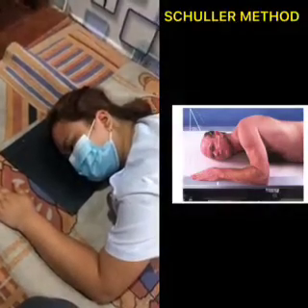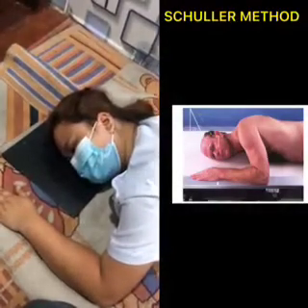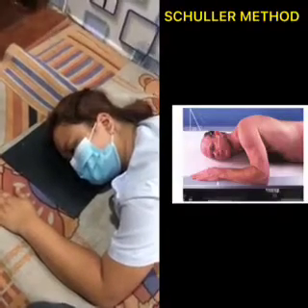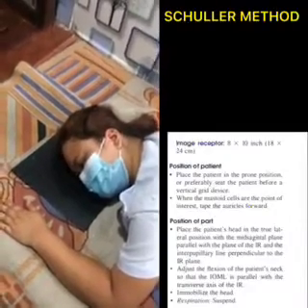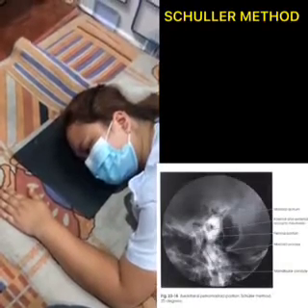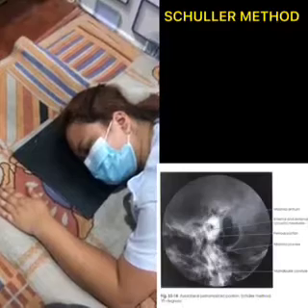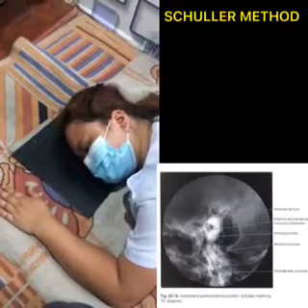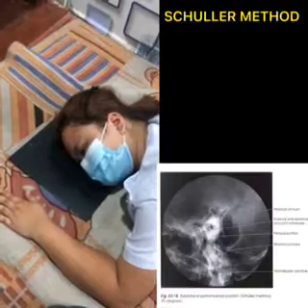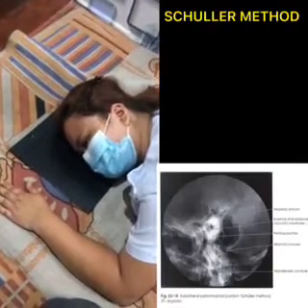Next, we have the Schuller method. The Schuller 25-degree method demonstrates the pneumatic structures of the mastoid process, the mastoid antrum, the external and internal acoustic meatus, the sinus and dural plates, and, when present, the mastoid emissary vessels, shown in figure 23-18.